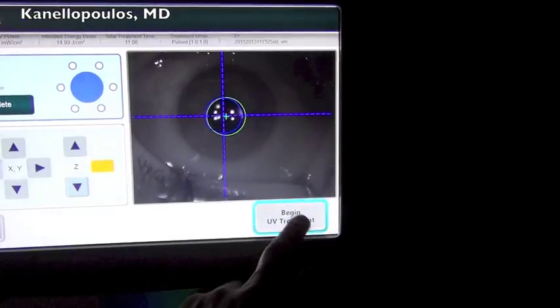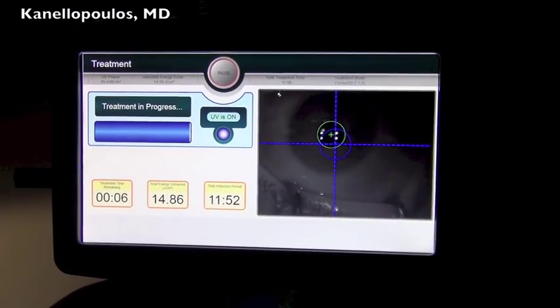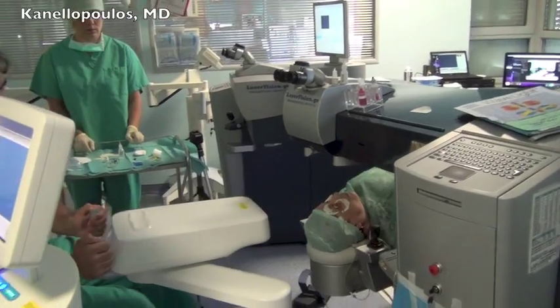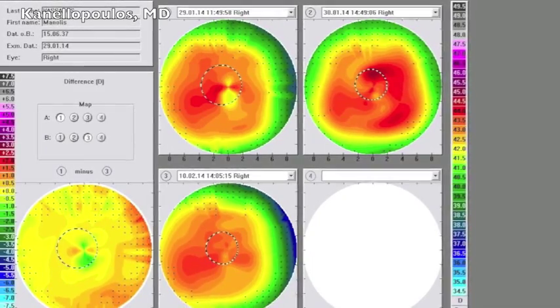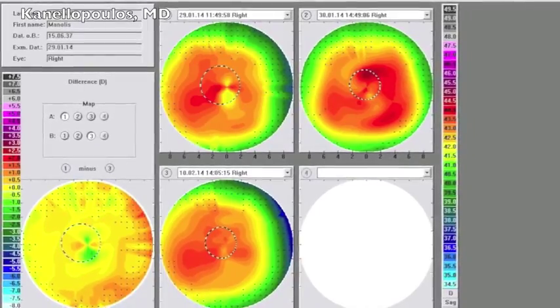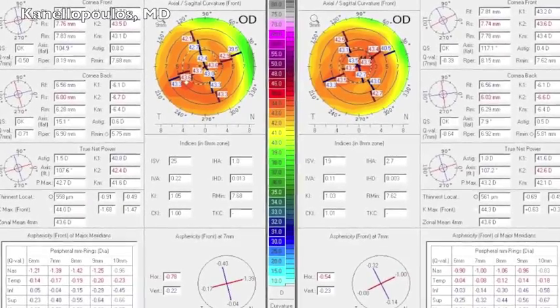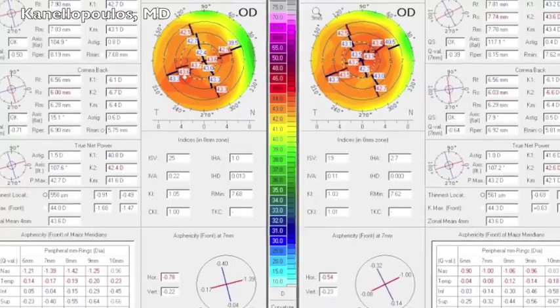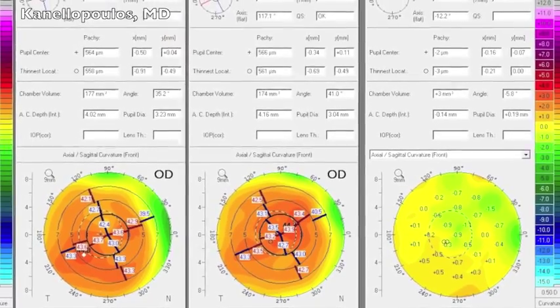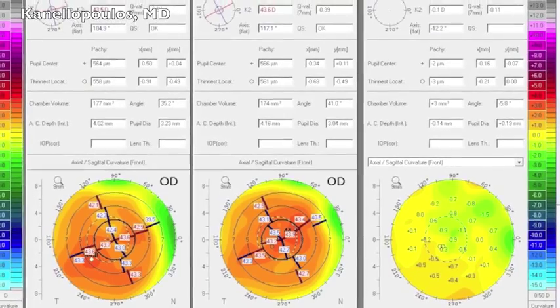We adjust the height, up and down adjustment, and you can see here the treatment in action, pulsing, continuous tracking, and then once we're done removing the device, you can see the remarkable difference before on the left here and after on the right, and significant treatment of this irregular astigmatism with just light, with just the customized treatment.